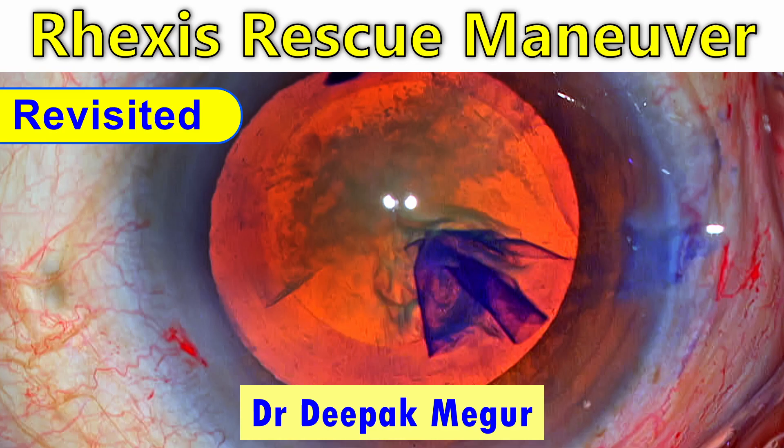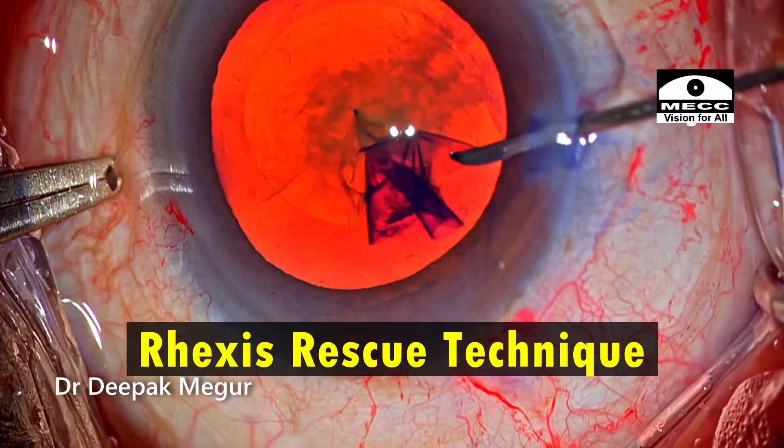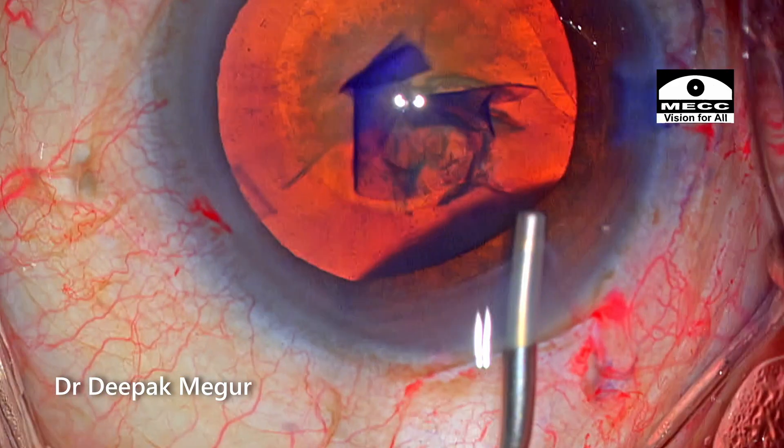Hi, in this video I'll be sharing the usual rhexis rescue technique, although with a slight modification. So what is this modification? Let's find out.